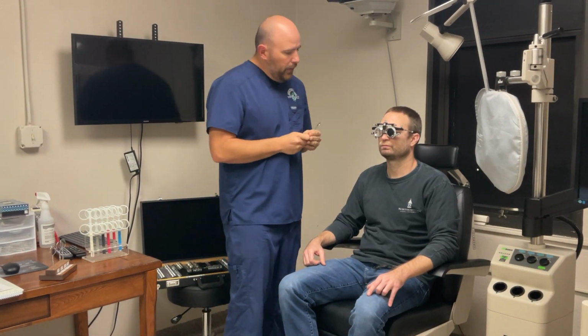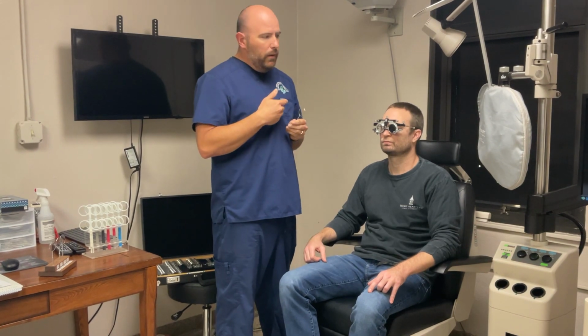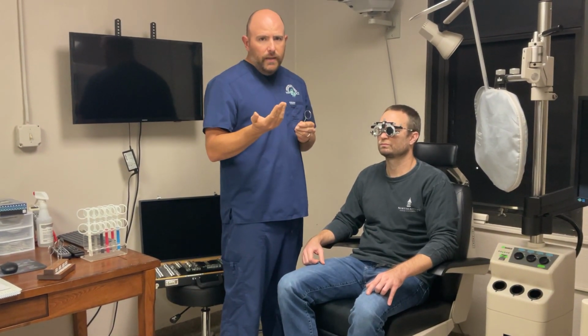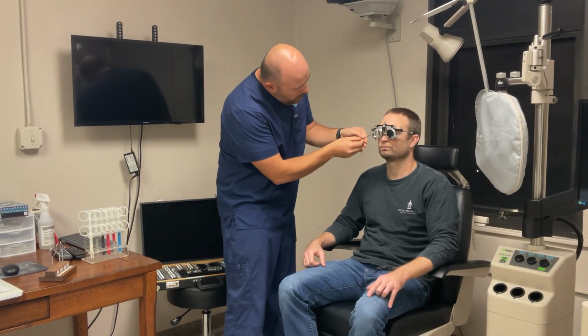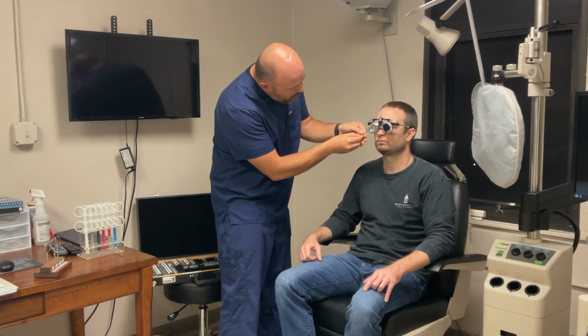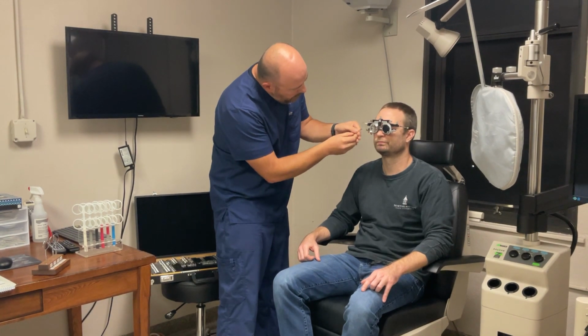and we found neutrality at 70 degrees, so that's where I'm going to put the axis back. All right, now we're going to check power again, and remember earlier he had kicked out some of this power, almost to the point of no cylinder. So we're just going to reevaluate that now that we found maybe a slightly different axis. Here's 1, and here's 2. Yeah, they're about the same. About the same there? Okay.